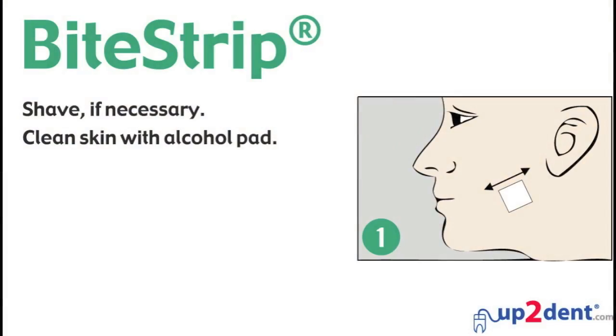Usage of the Bite Strip. Shave, if necessary, and clean your skin with the alcohol pad.